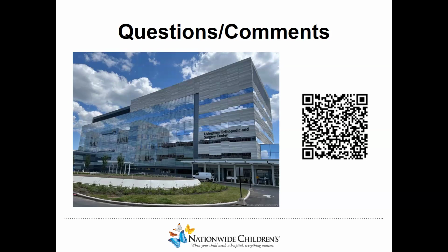As you had mentioned, with these injuries, I think it is very helpful and useful to use ultrasound, in the sense that with some of these patellar subluxations, you may actually not injure the MPFL. And in those cases, they can sometimes have different management. But the more we're learning, if you do have complete disruption of that MPFL and you can identify that fairly early, that is going to be a game changer for management.